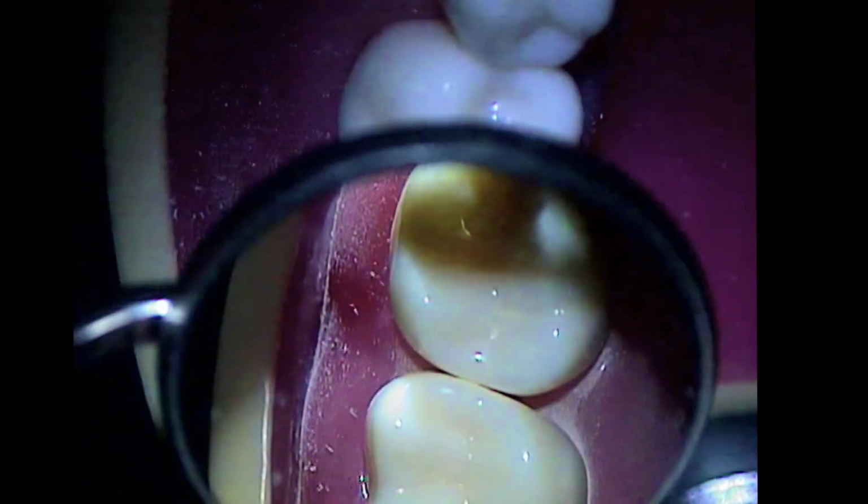You're making some progress. So, yeah, we won't have too much time to actually start on a DO over here. That's okay. But see if you can get rid of the excess over here, clean this up with a 55 burr, and then define those corners really well, and put some retainer grooves in. All right?